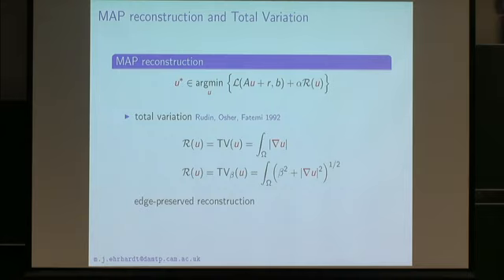There are different formulations of how you can phrase the total variation prior. In its original formulation in the central row, you can see that it is non-differentiable. Smooth variants have been proposed such that we can do a gradient-based optimization when we use this as a prior.